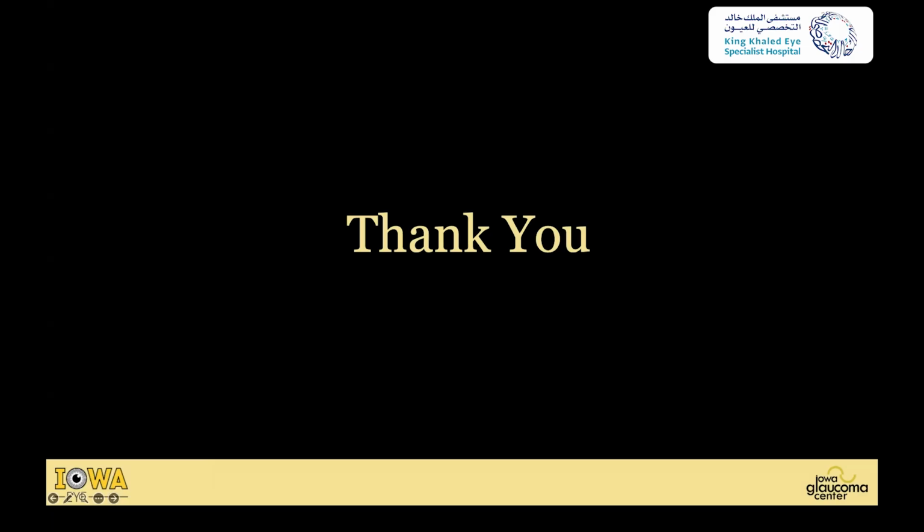I think it's more reason to make sure that you're not bouncing around the eye when you're going across the eye with your instruments. Making sure that you go across first, and then placing the prism, is even more important because you don't have that iris protection.